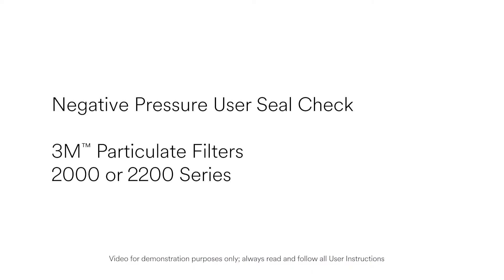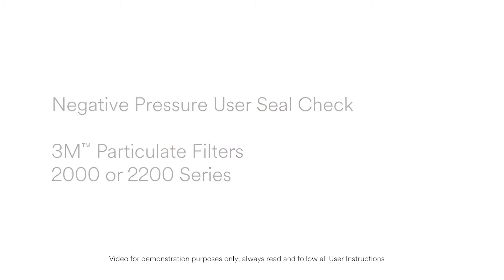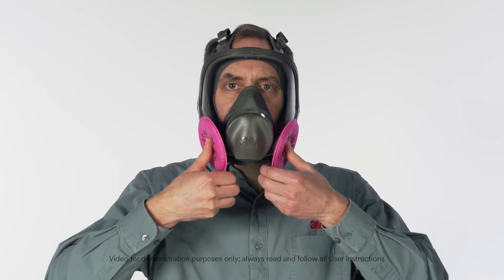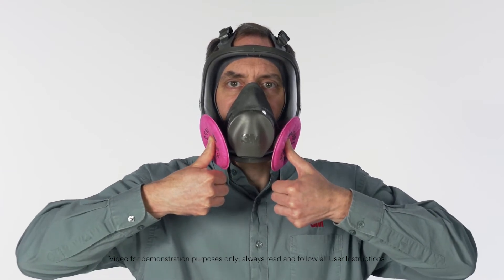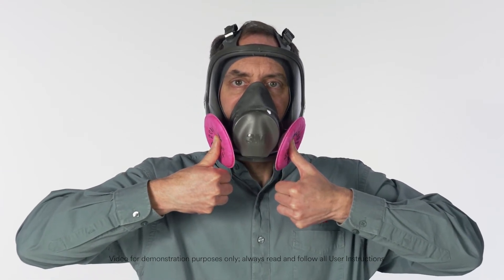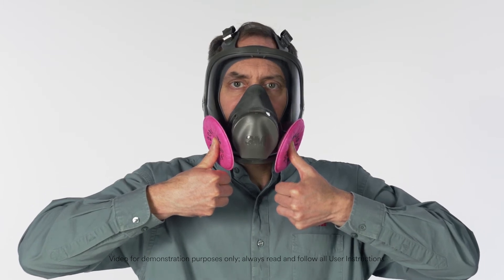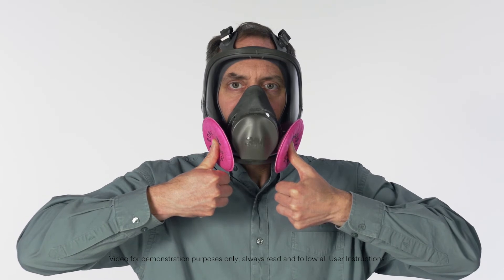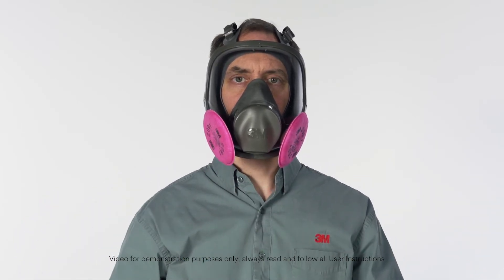To perform a negative pressure user seal check with the 3M Particulate Filters 2000 or 2200 Series, position your thumbs over the center of the filters to restrict airflow through the filter. After you've sealed the filter inlet, inhale gently. If the facepiece collapses slightly and you feel no air leaking between your face and the face seal, your respirator has sealed properly to your face.